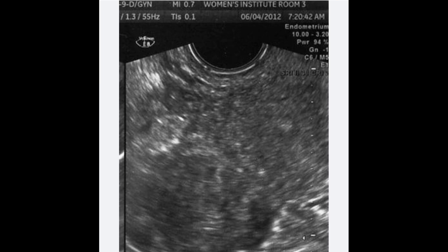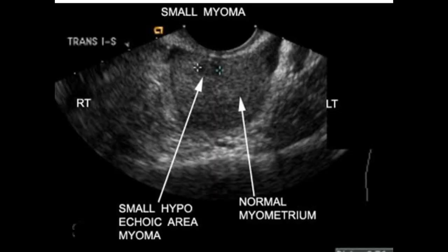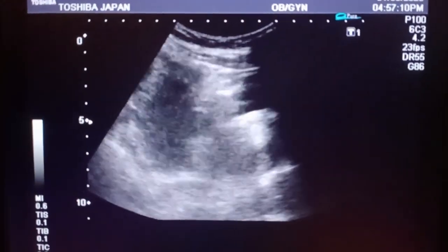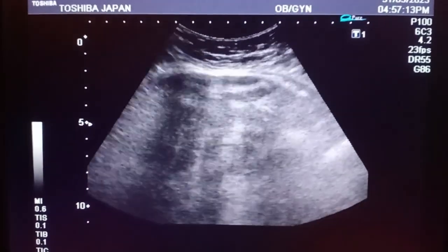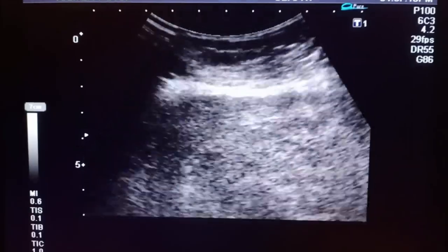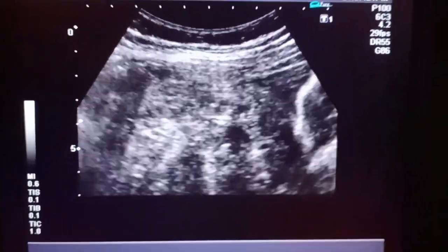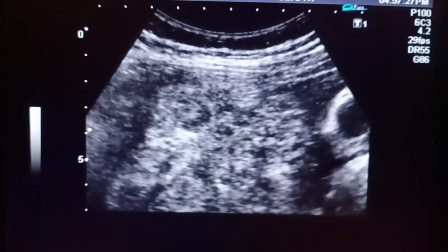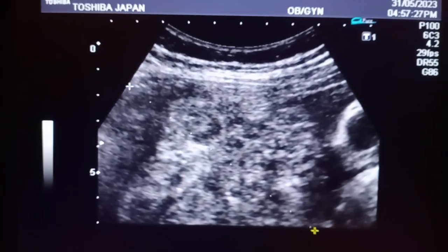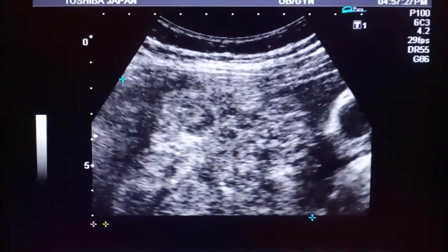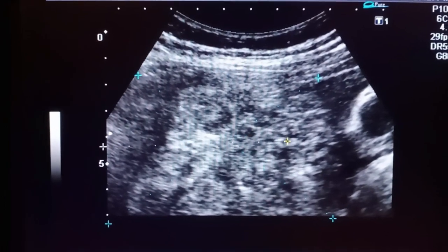These are the ultrasound images of the fibroids. You can see a large mass that is heterogeneous on TVS — transvaginal ultrasonography. The fibroids are present within the uterus. You can appreciate the mass has ill-defined margins, and the shape is resembling that of a fibroid. They are multiple in number.